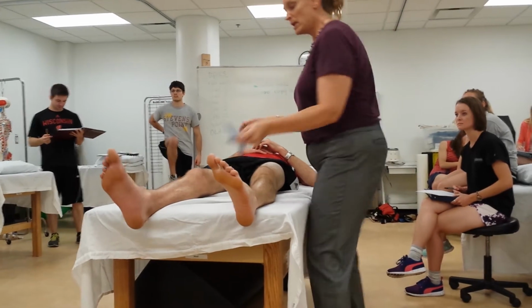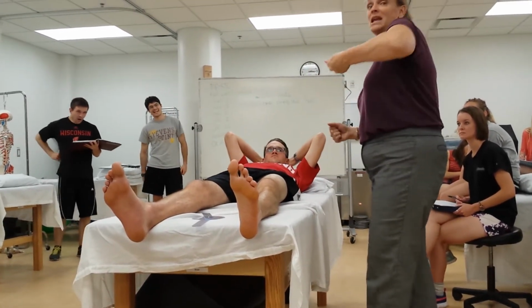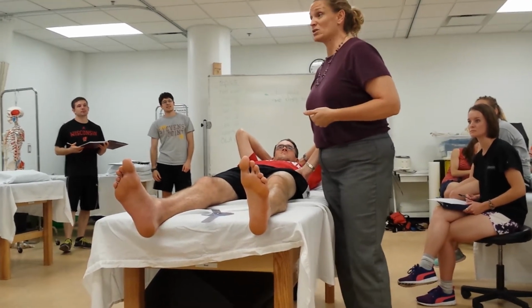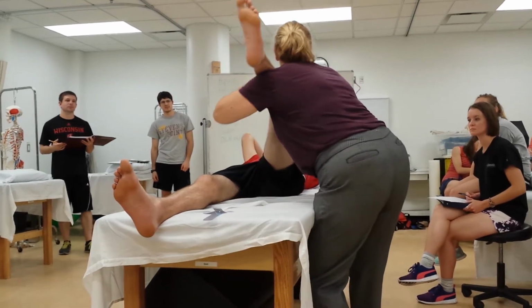Now, one thing I didn't say is to get end feel, you're going to have to take him to the extreme of his motion and let the pelvis move to actually get the end feel. Okay, so I did not demonstrate that. So go ahead and relax for me.